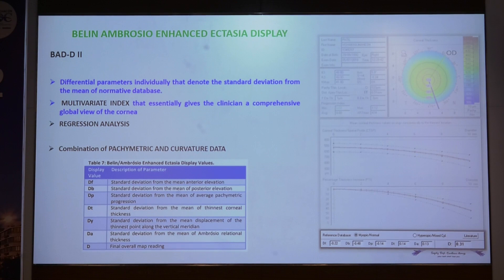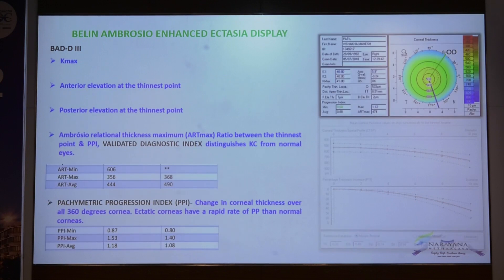BADD2 is a multivariate index that gives a clinician a comprehensive global view of the cornea. It has parameters that denote the standard deviation from the mean normative database and is a combination of pachymetric and curvature data. Recently, BADD3 has been introduced, which incorporates Kmax, anterior elevation at the thinnest point, posterior elevation at the thinnest point, and ARTmax into the BADD2.